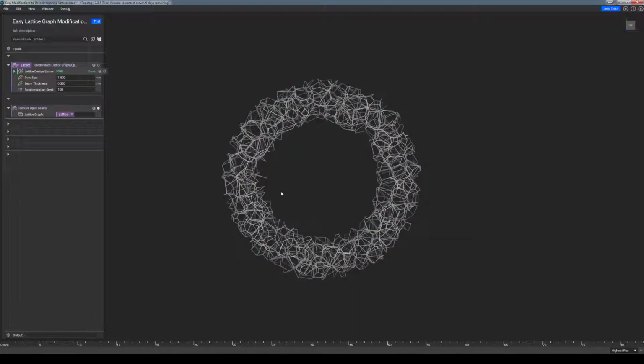So if you are an orthopedic device designer, and there is some concern within your organization that open lattice beams may snap off during abrasion testing or even break off inside the body, this is a really easy way to remove that concern entirely by digitally ensuring that there is no lattice beam jutting out on its own.